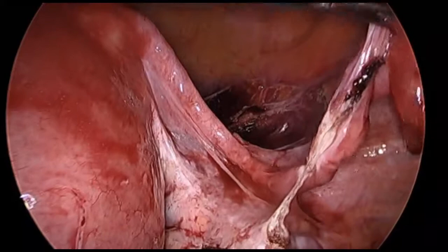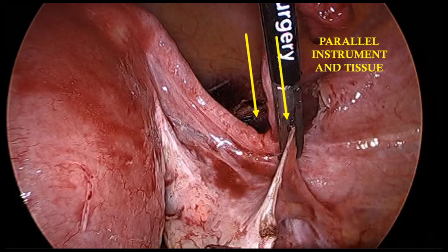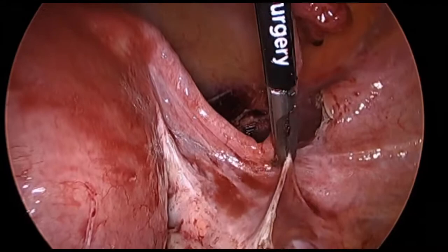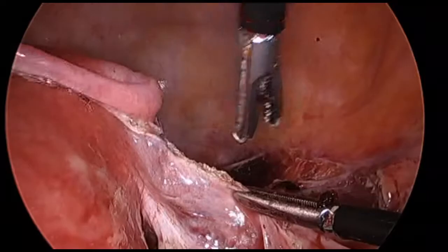The surrounding pathology dictates where we begin the salpingectomy. Here we begin at the fimbriated end with the vessel sealer through the suprapubic port. The surgeon provides most of the necessary assistance while the assistant provides gentle counter-traction, which improves the efficiency of the dissection. Care is taken to ensure that the fallopian tube is positioned parallel to the vessel sealing device, which optimizes exposure and ergonomics. The fallopian tube is left attached to the uterus and is ultimately removed with the uterine specimen.